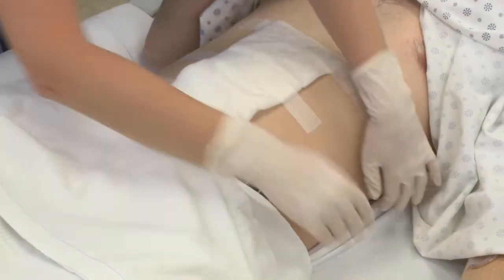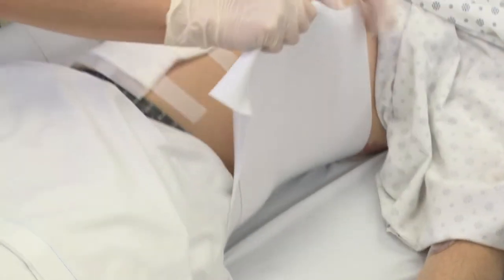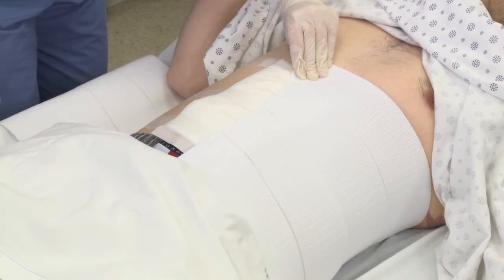Using the patient's weight as an anchor, stretch out the end of the binder which is on the patient's left and hold it in position across the stomach with one hand.